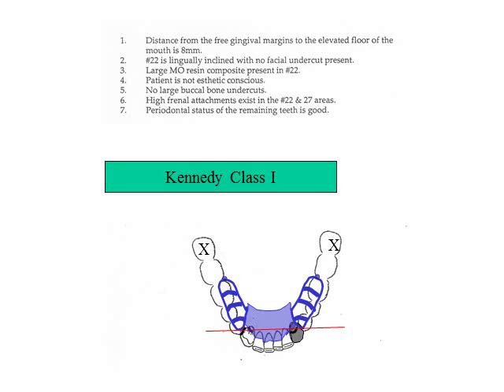The acrylic base covers a minimum of 2/3 of the retromolar pad. Retention is provided with 2 wrought wire clasps engaging mesial undercut in the gingival 1/3 of the tooth. The facial surface may require adjustment, if possible, to ensure that the wrought wire may be adapted closely to the tooth along the entire facial surface.